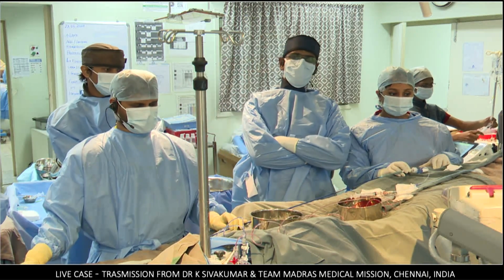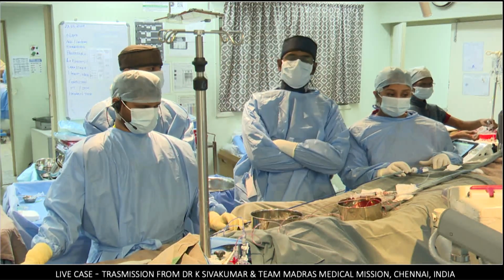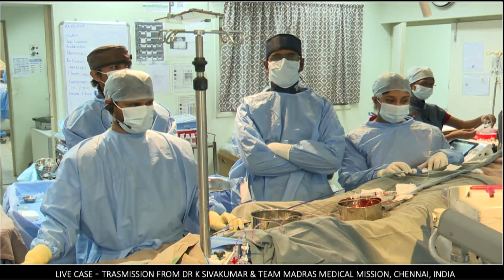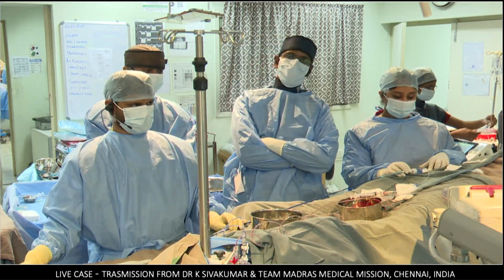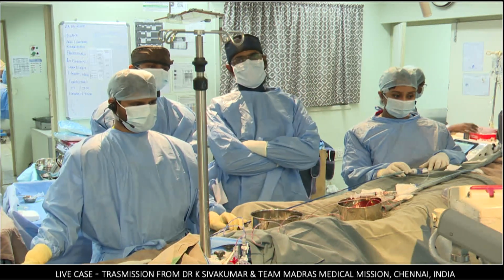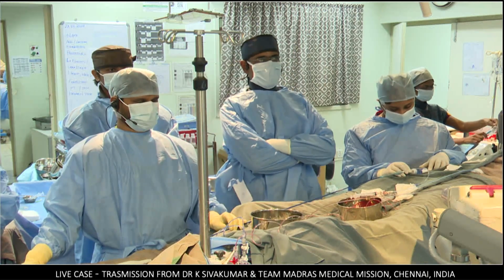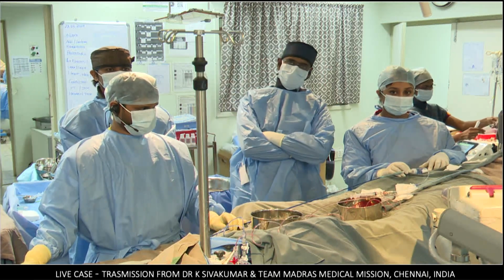She's planning to soon get married and start her family, and so multiple considerations fell in place. There was an onset of RV dysfunction on the MRI with ejection fraction falling down. The pulmonary regurgitation fraction was more than 65%. The patient was increasingly becoming symptomatic and is having a possibility of an impending pregnancy in the near future. So we decided to go for a valve implantation.